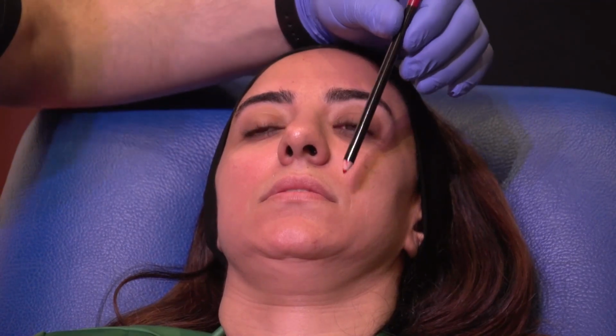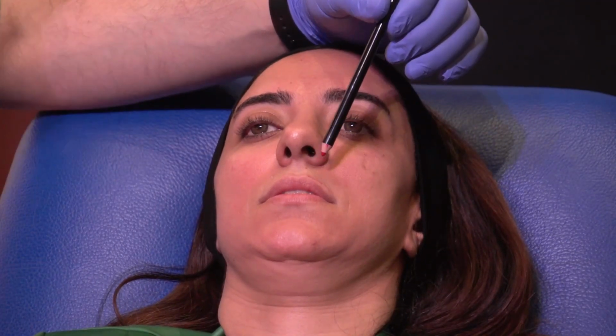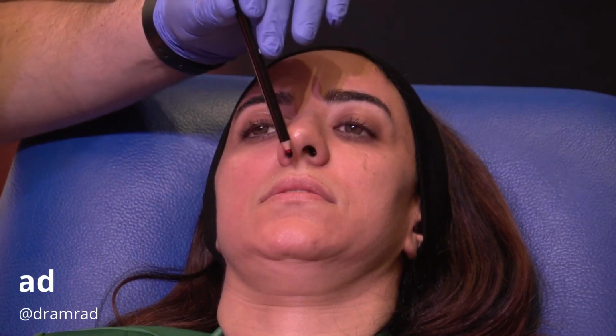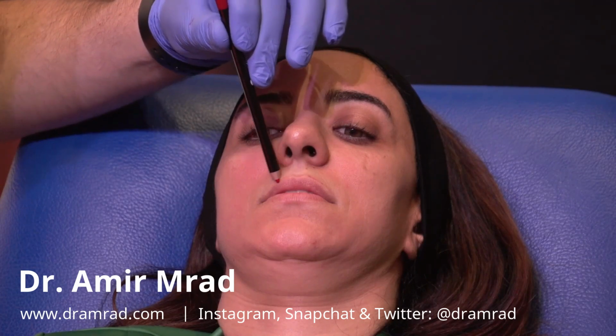So one area is the contouring of the lip. I find it less common in the Middle East to need contouring. Most of them have a good vermilion border, very distinct. They might want to control it with some makeup. So I rarely inject the vermilion border, okay?